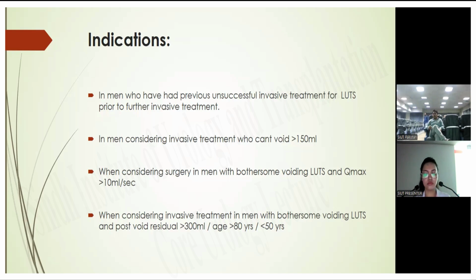So you have to assess that, you can order a urodynamic study. Similarly, if the post-void residual of a patient is greater than 300 or greater than 500, because normal capacity is 400 to 500. If his post-void residual is 800 or 600, that means the patient must have an underactive bladder. It is a large capacity atonic or underactive bladder.